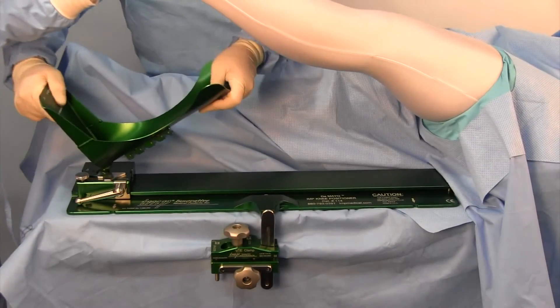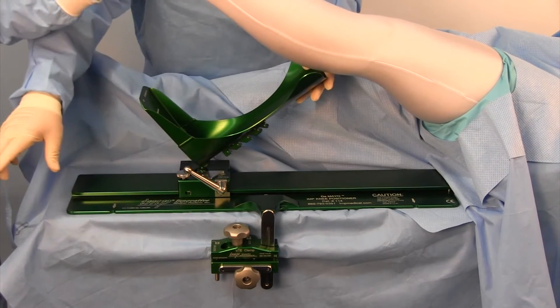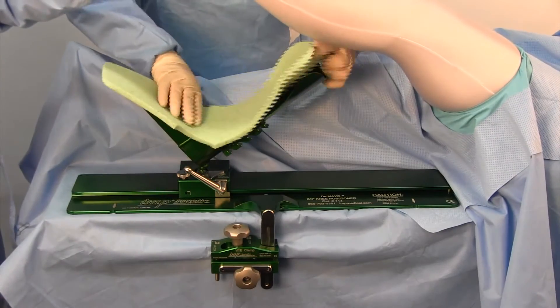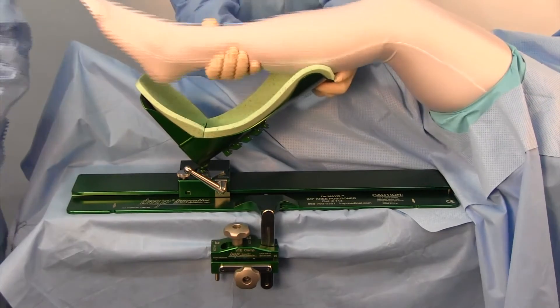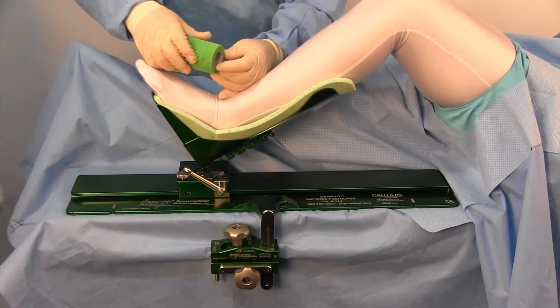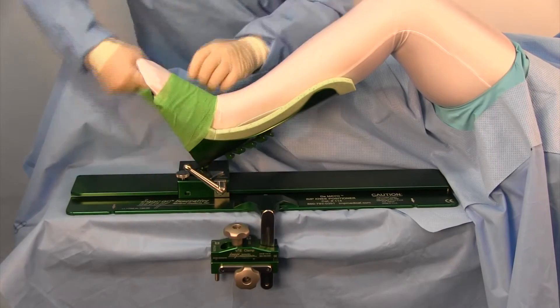The easiest way to put the foot into the boot is to lock the boot into the positioner. Then place the IMP protective boot pad into the boot, making sure to cover the calf and the toe regions entirely. Place the foot into the boot. Wrap the top of the boot — a minimum of six wraps if you are using the IMP distractor.